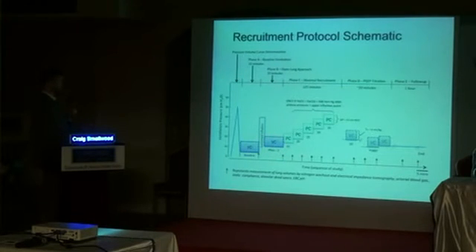We did lots of stuff here because with research, basically once you get a protocol approved, you want to answer as many questions as possible. So we were doing a lot of stuff before we got to the actual staircase. But we did a P-flex +2. All that means is we look at the PV curve. So if the PV curve looks like this, we look at the lower inflection point and then set the PEEP 2 centimeters of water above that inflection point that was automatically determined on our ventilator.